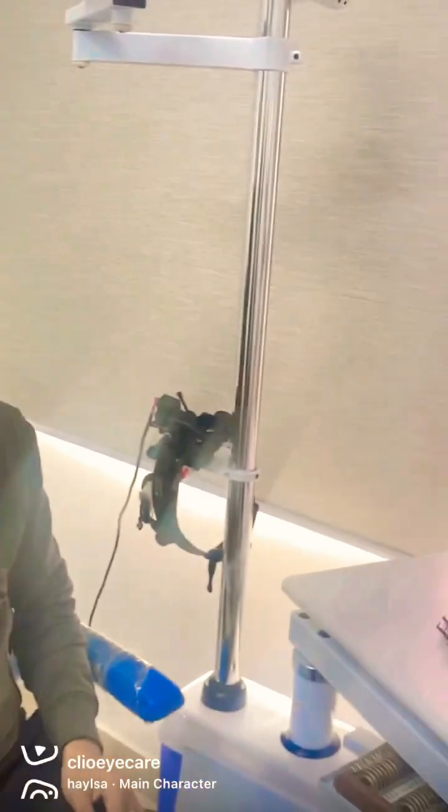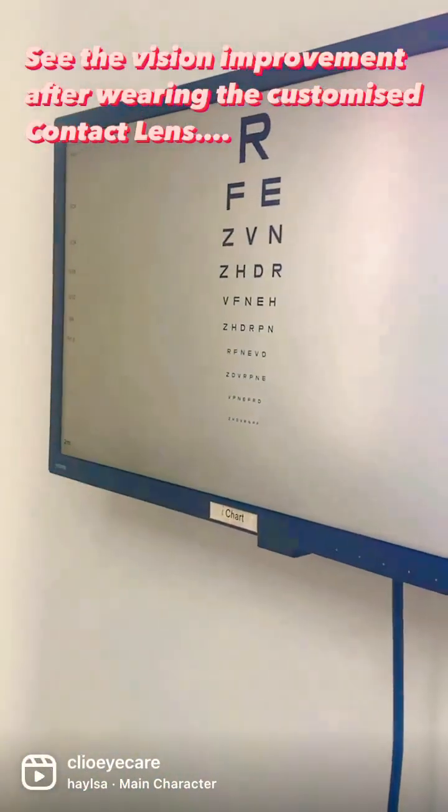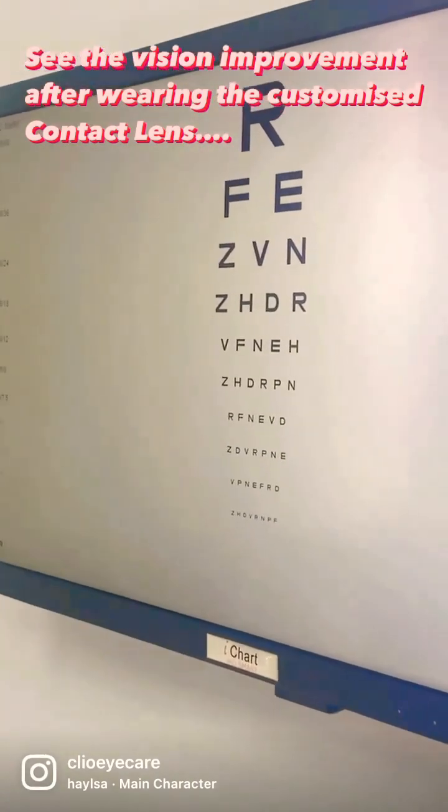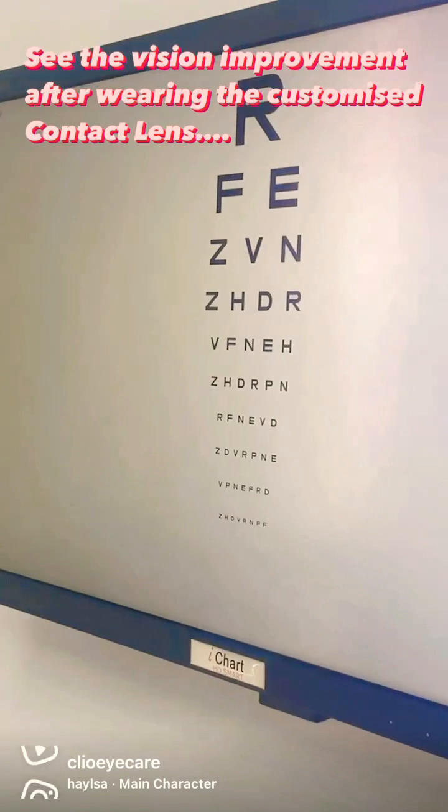You are wearing your mini scleral contact lenses now today. Your lens has been dispensed, so with both eyes with the lens on, I want you to start reading the chart now. Please start reading from top.